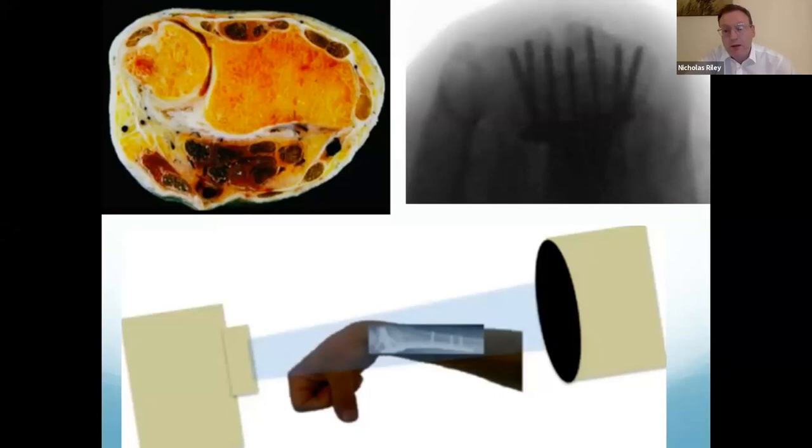And for the lunate facet, I've used hand plates. So I've used 2mm hand plates if there's nothing else available. So just think laterally. The other thing is that if you can't find a distal radius plate to fit, you've not got one in, have a look at the foot and ankle sets, because they've often got some nice fixation kit that you can use.